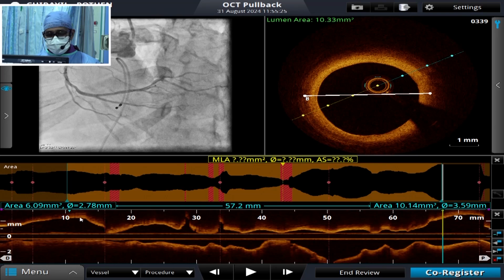So probably a 3.5 stent, with a not very aggressive deployment, would be ideal, with 3.5 post dilatation in the distal portion and 4 mm post dilatation in the proximal portion. We'll do modification with orbital followed by a non-compliant balloon, because again the cost issues are always there. So the balloon based strategy, the first option would always be a non-compliant balloon. So we go with orbital now.